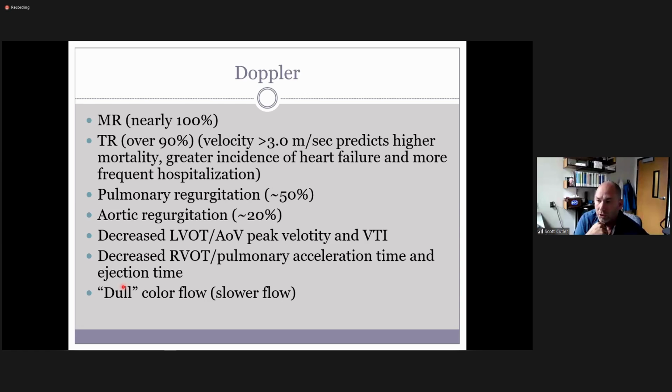I would get all the walls. I would do my systolic and diastolic function. And in my 2D, I'm also going to be showing the valves. So I need to know valve function. I need to know how the walls are. We're going to rule out definite ischemic cardiomyopathy versus dilated cardiomyopathy. So definitely showing the walls and measuring them and the chamber sizes.